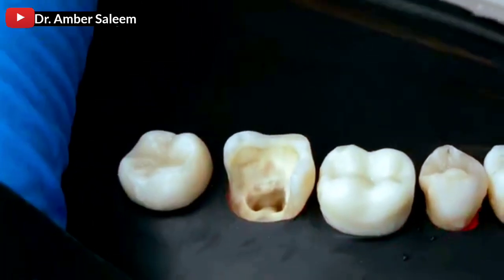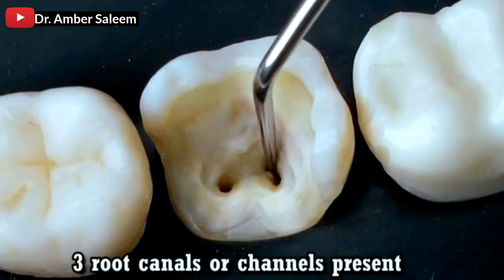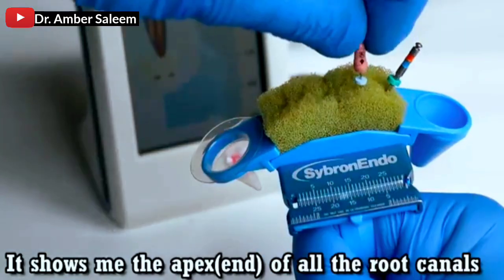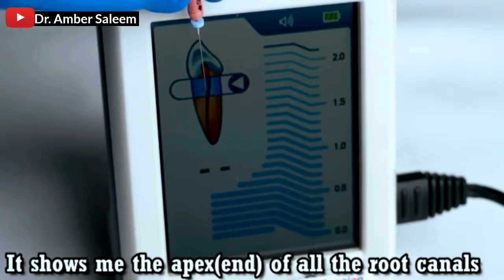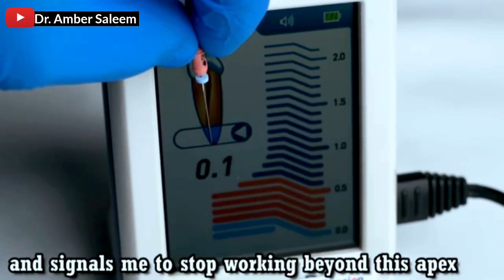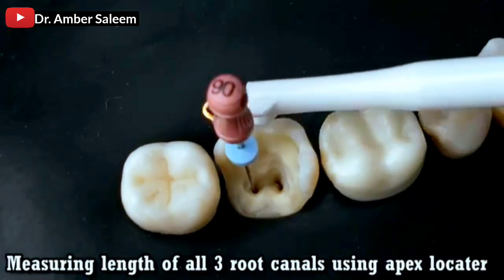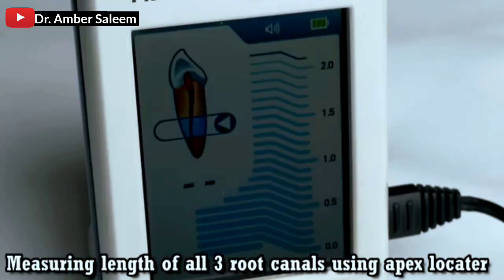Three root canals are present. This device is called an Apex Locator — it shows me the apex end of all my root canals and signals me to stop working beyond this apex. Measuring the length of all three root canals using the Apex Locator.